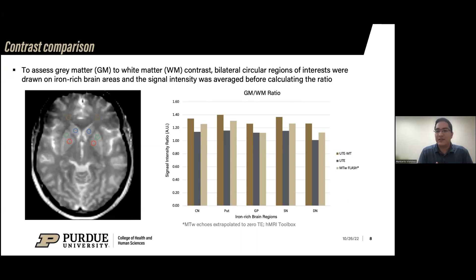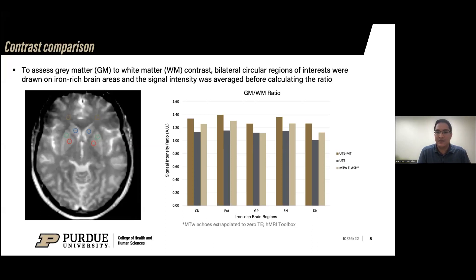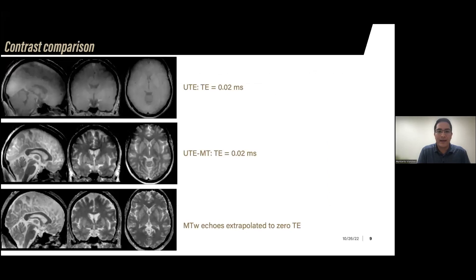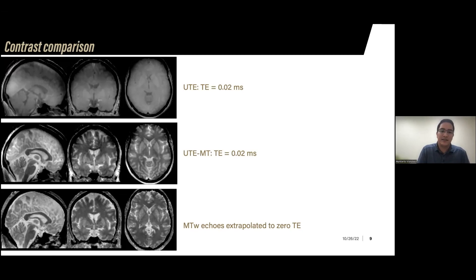For the UTE-MT, it was very simple — just regridding of 40% of the k-space data — and we still see improved contrast even though we haven't done a lot of corrections to the UTE data. Here's an overview of how the data looks: on the top we have the UTE at the 20-microsecond echo time with no MT pulse, then the same sequence with the MT pulse applied, and then the MT-weighted image extrapolated to zero echo time. The ROI analysis still shows a higher ratio of gray matter to white matter contrast in the UTE-MT compared to the UTE without MT.